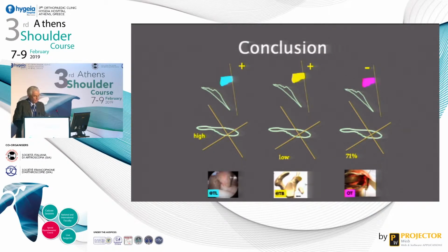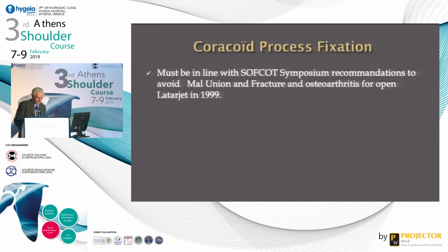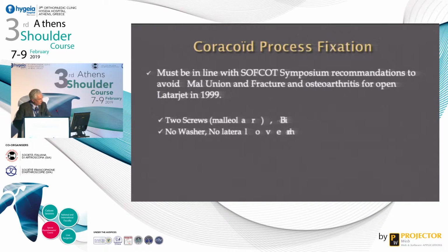But the conclusion of the symposium was there is no difference between endoscopic technique and open technique. I disagree with this conclusion, because radiologically it's totally different. I mean, you need to improve the arthroscopic technique to have better positioning of the screw to be very comparable to the open procedure.